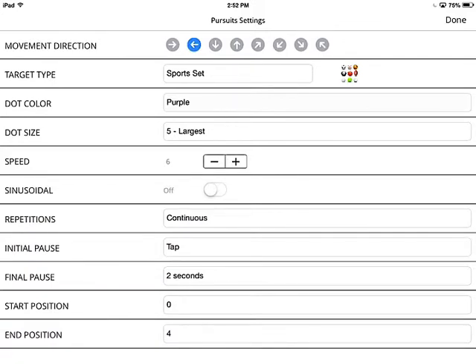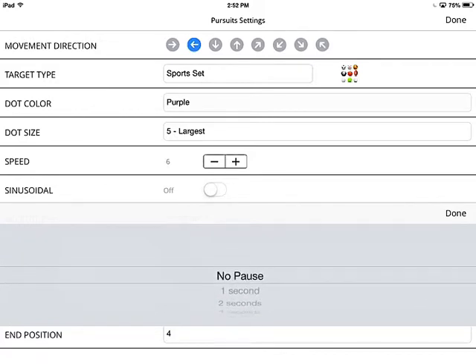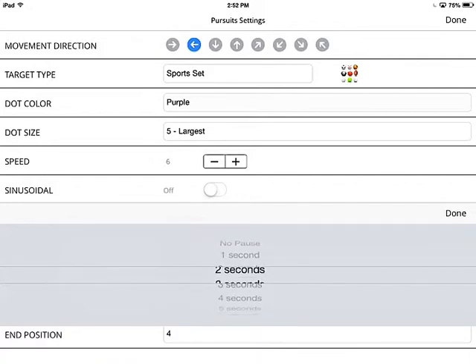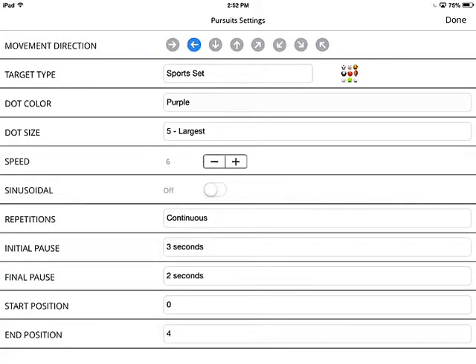The initial pause gives you the option to decide how long you want the target to hold its position before it starts moving. No pause will start right away, which is how the previous Focus Builder app worked. It's really nice to have a built-in timer, or you can choose tap — meaning the movement won't begin until you tap the screen. I'll keep it at 3 seconds, which is nice if you want your patient to do a gaze stability exercise before the movement begins.